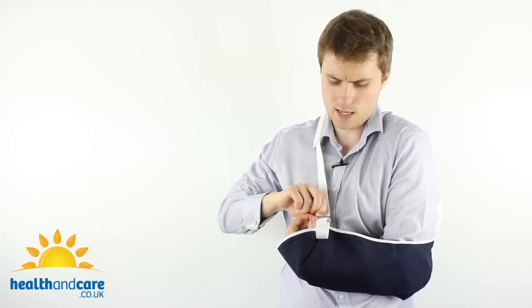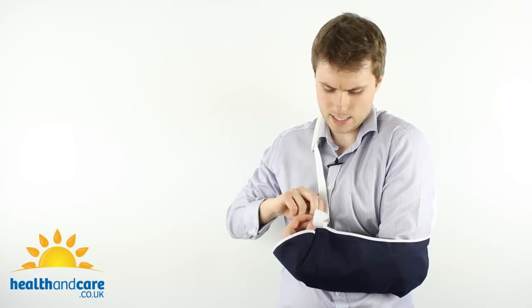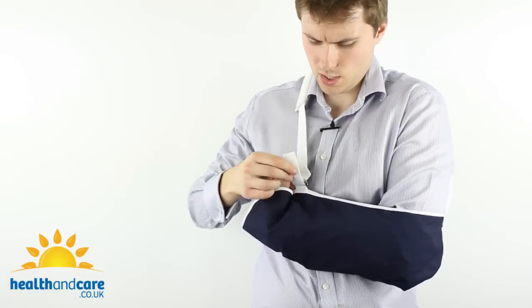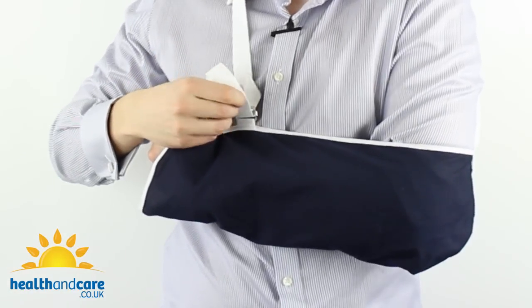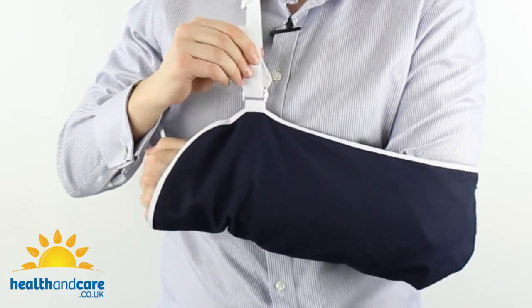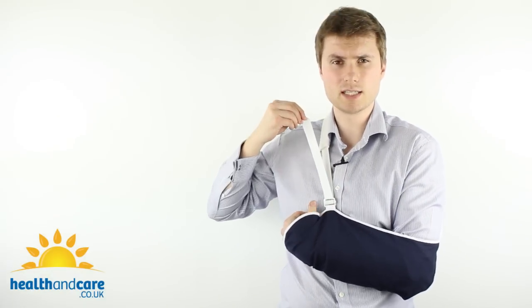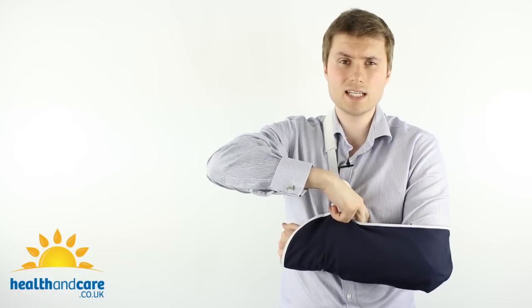Once you've threaded it through that gap, don't tighten it completely just yet. The reason for this is that it's quite difficult to adjust while you're wearing it. So the best thing to do is tighten for the correct elevation at this stage, hold it into position and then pull tight. Any excess strap can simply be tucked into the envelope of the arm sling or snipped.